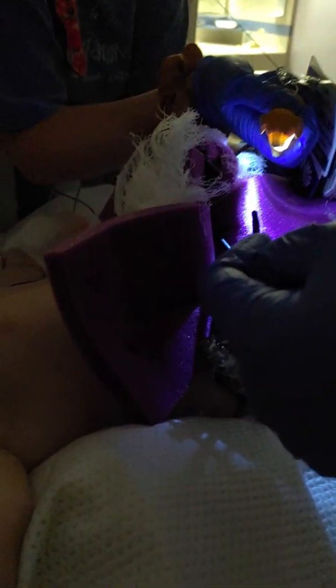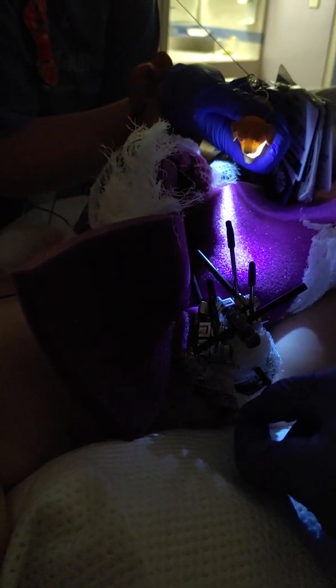And with X-fixes, the more bars, the more pins, the longer it lasts. So the minimal amount of pins to last four weeks is basically this. We would have had to have more up here, and I don't think he's going to need that. He's doing so awesome.